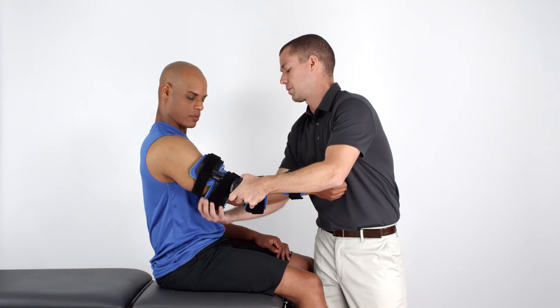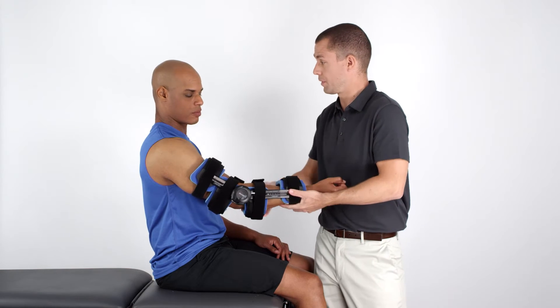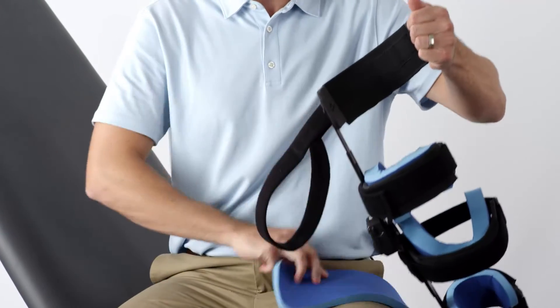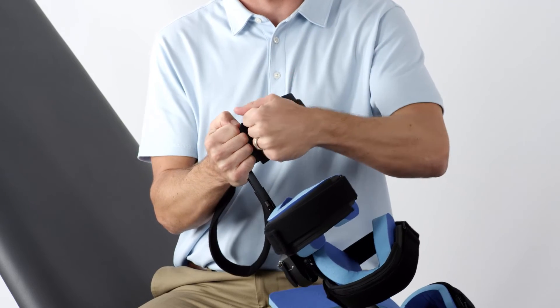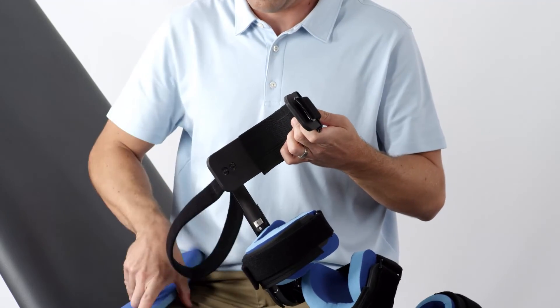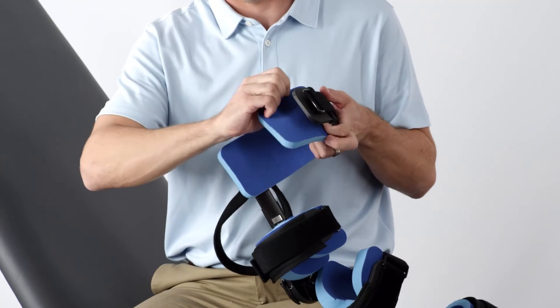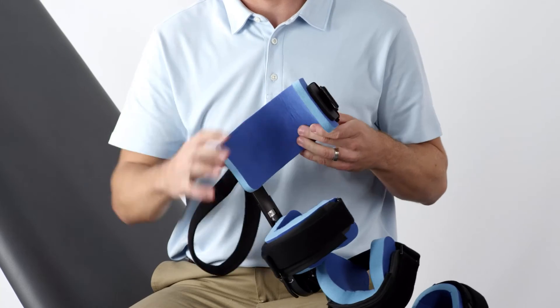After you've adjusted the struts, shape and mold the bendable contour cuffs to the patient's limb to assure a snug yet comfortable custom fit. Advance's unique contour cuffs are made of an aluminum insert and rubberized coating that enable you to bend and twist the cuffs easily. The blue memory foam pads, which are attached to the cuffs by Velcro, may also be repositioned or even trimmed and sized to maximize fit and patient comfort.